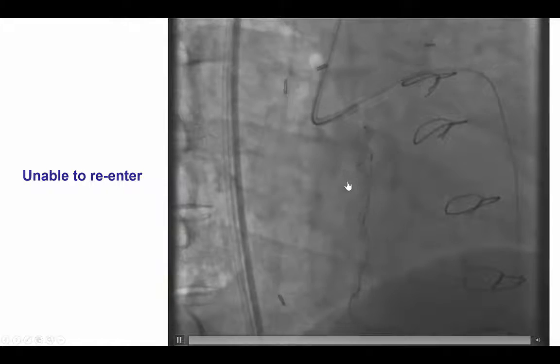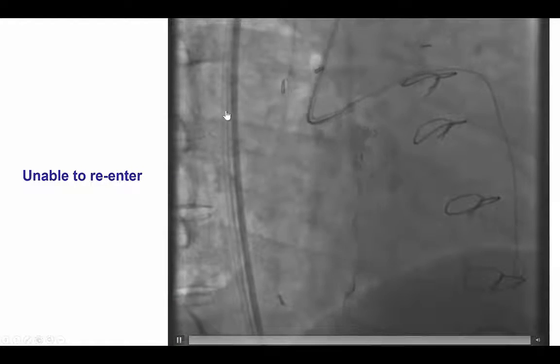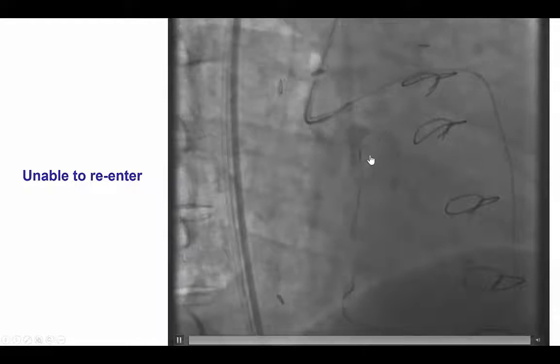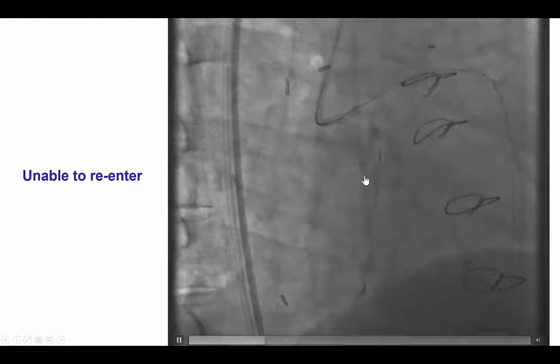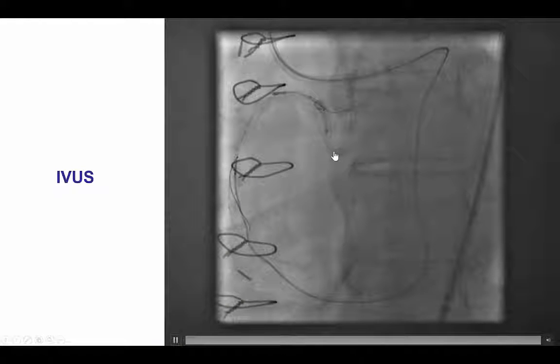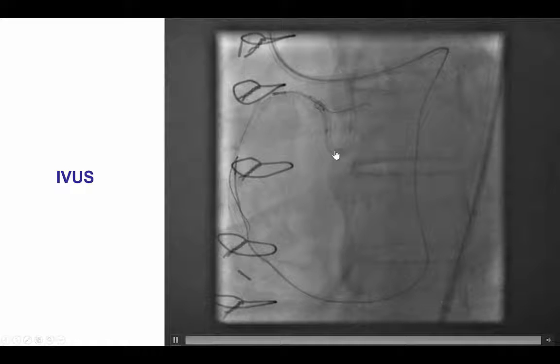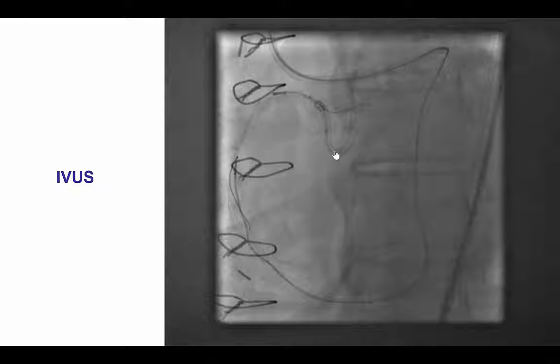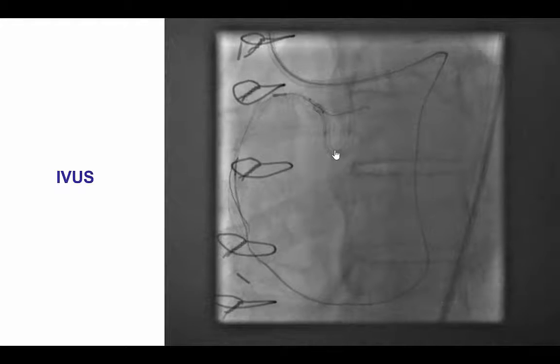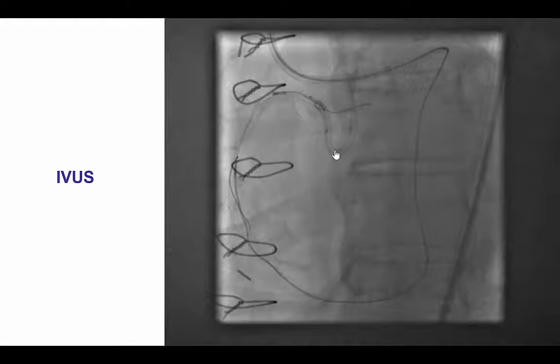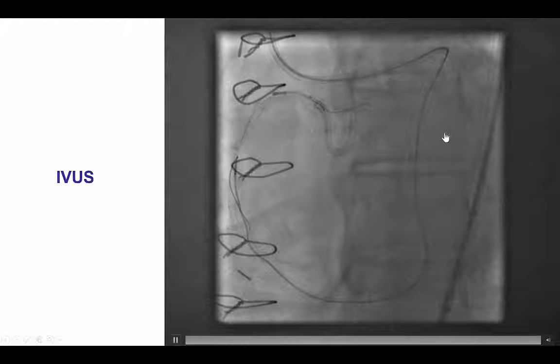We tried to perform reverse CART in a different location, in a higher part of the mid-RCA; however, we again had difficulty advancing. We then performed intravascular ultrasound to determine whether we needed to use a larger balloon. We had been using 2.5 and 3.0 mm balloons until then, but after using IVUS, we upsized to a 3.5 mm balloon, which allowed the retrograde pilot wire to advance more proximally.